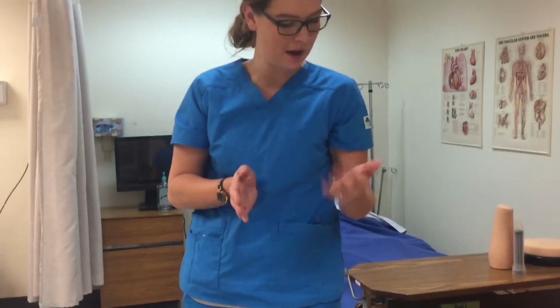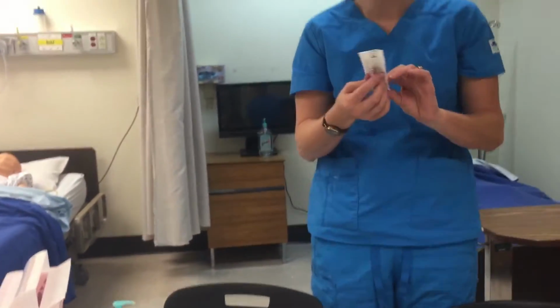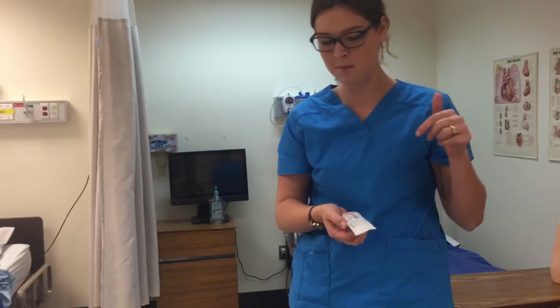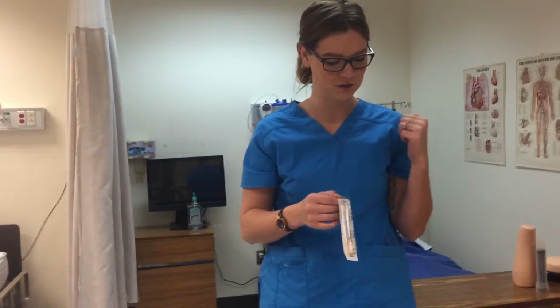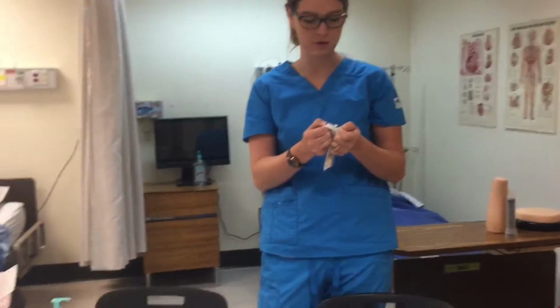Okay. Now I'm going to prep my TB injection. So, oh, and for the record, I noticed that Amy was a muscular woman, so I used a 1.5 inch needle for her, okay? I noticed her body shape and size when I assessed her the first time when I was in her room.